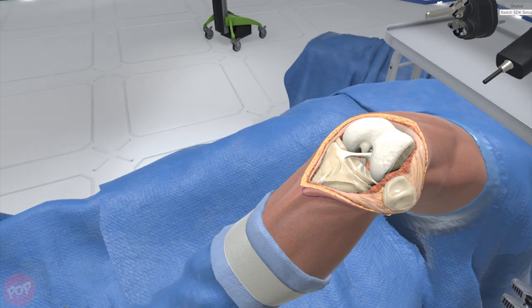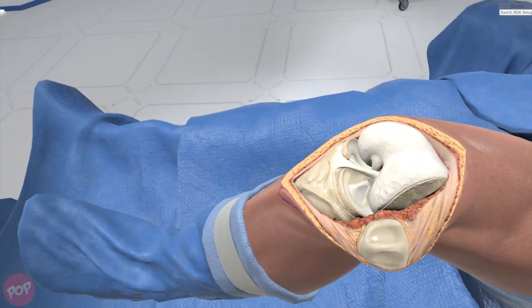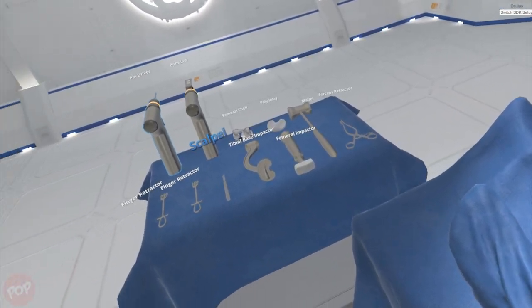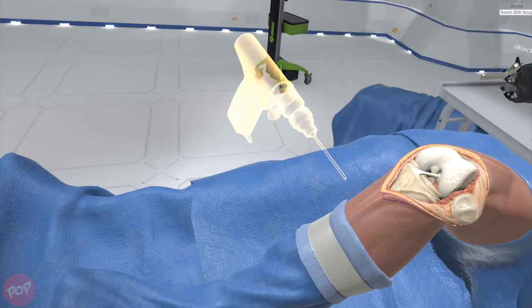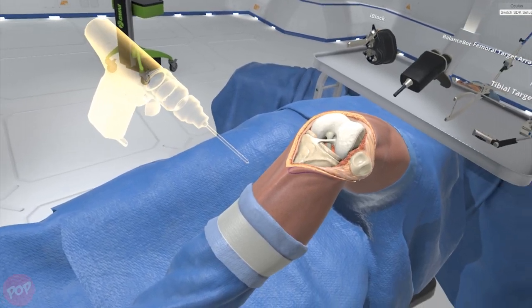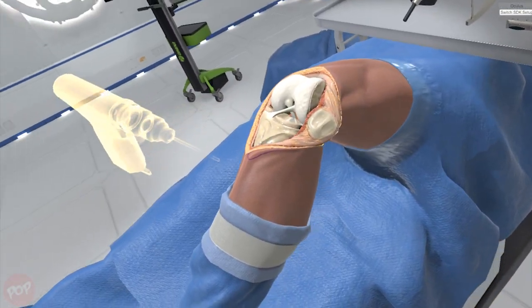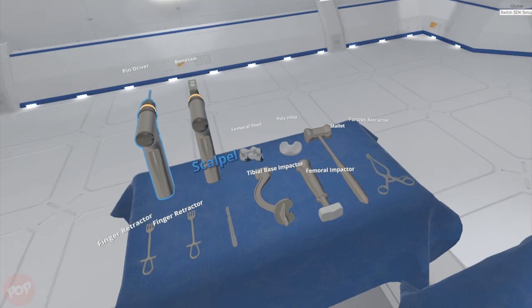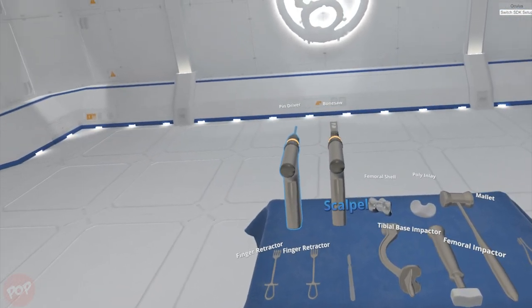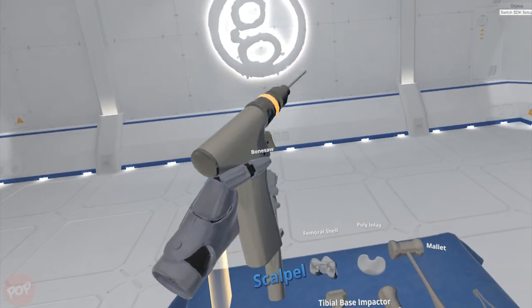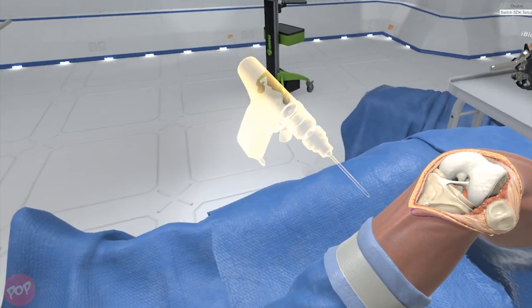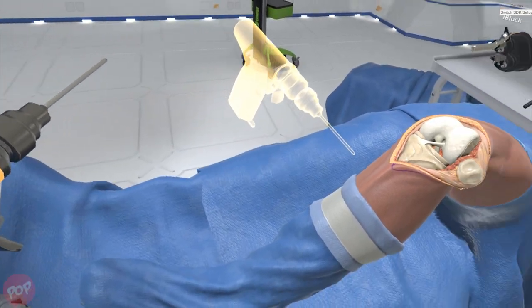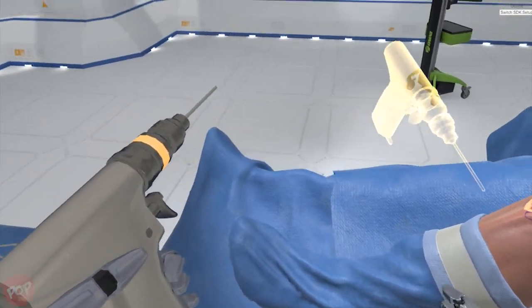The first pin is installed four finger widths below the incision site. Grab the pin driver. For this simulation the pin driver will have the necessary pin already loaded. Pull the trigger to install the anchor pin and secure the tibial array to the anterior tibial cortex.